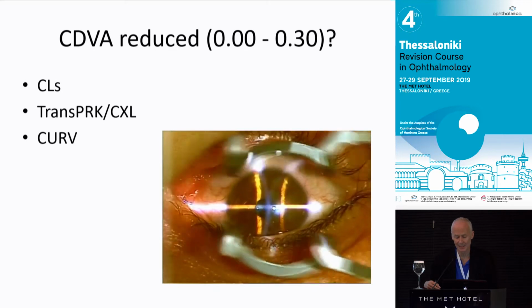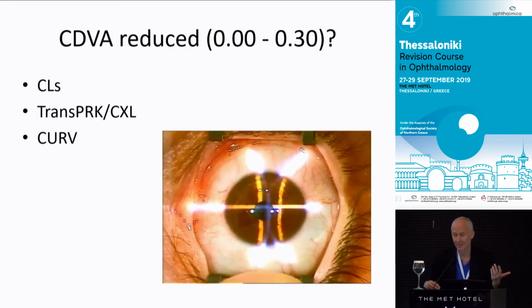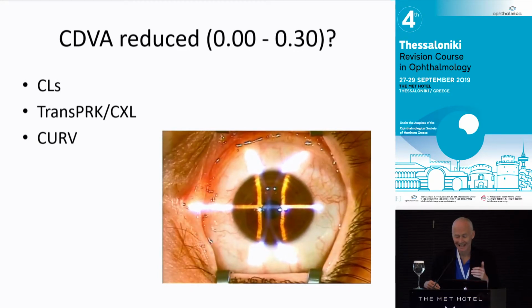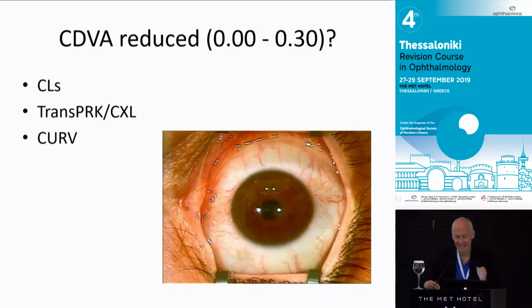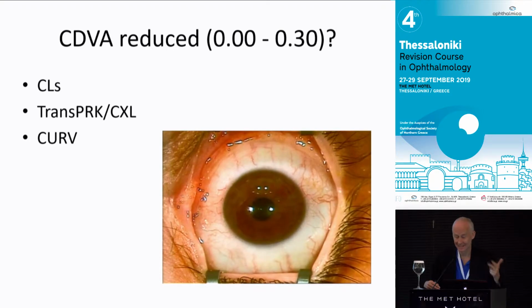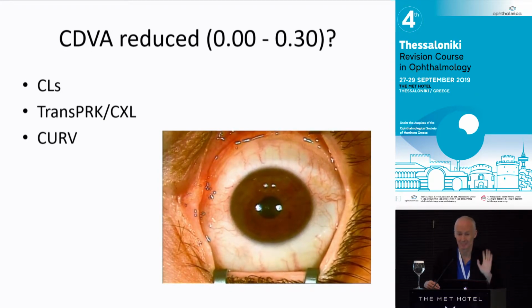This treatment is a modern surface laser treatment. It couldn't be simpler. We just take a registration photograph, put the speculum in, and deliver the treatment before the tear film breaks up. So it's no-touch surgery. It's easy to do, it's easy to repeat. It's safe, but it's painful. So the reason we still have LASIK and SMILE is because of pain after treatment. That's primarily it.